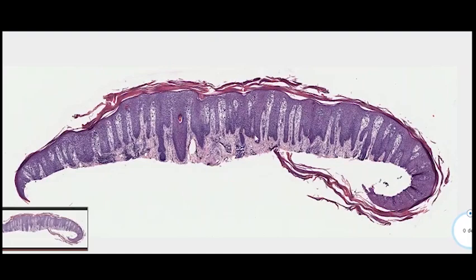Today, I will help you learn how to recognize a psoriasis patient. On low power, you'll find what's called psoriasiform epidermal hyperplasia. It means we have an acanthotic epidermis with elongation of rete ridges. Look how long the rete ridges are, with preserved rete-papillae configuration. This is the rete ridge, and in between are the dermal papillae.